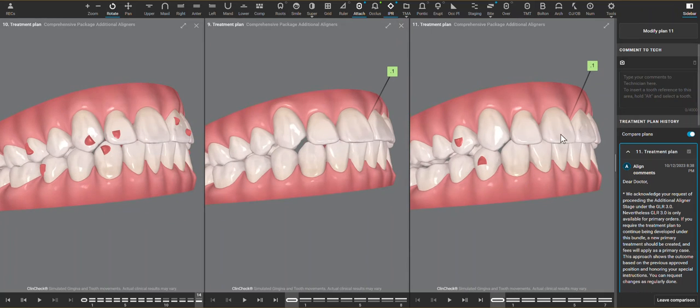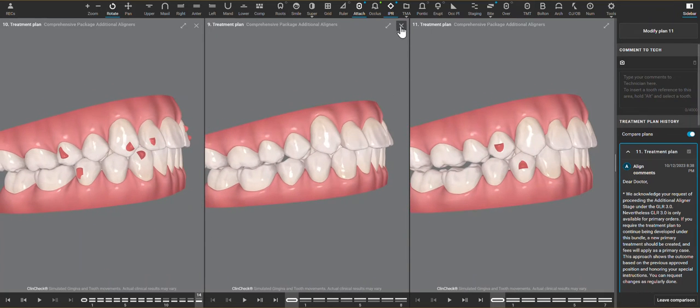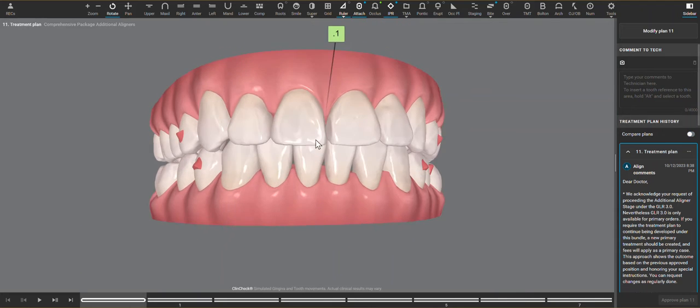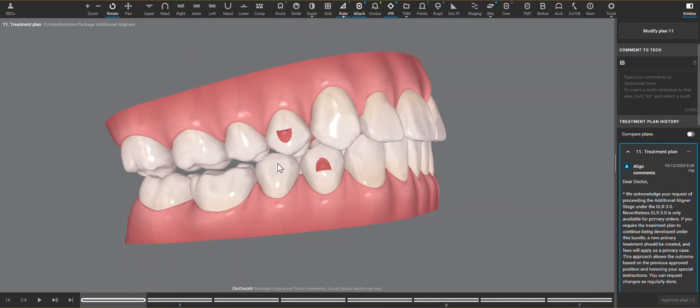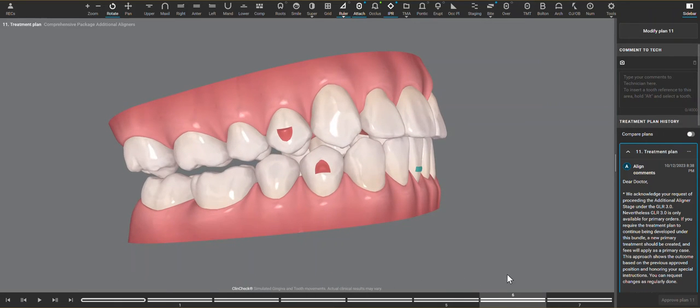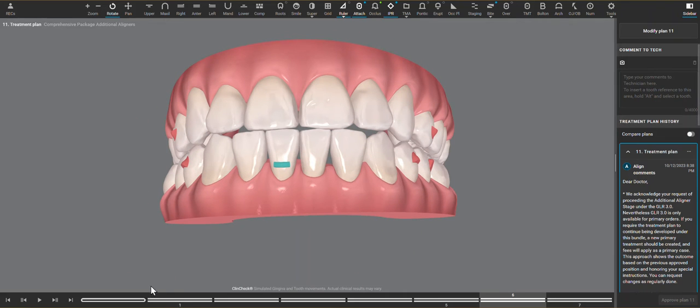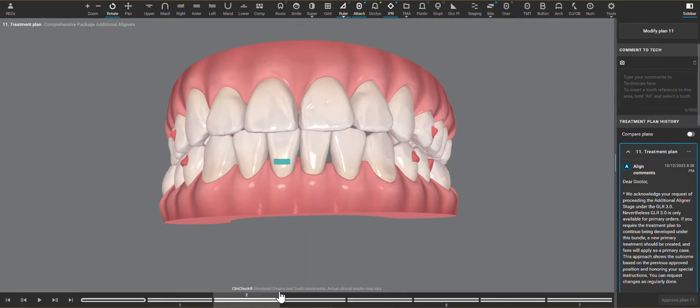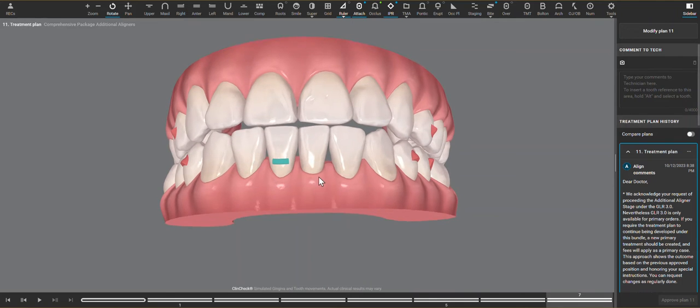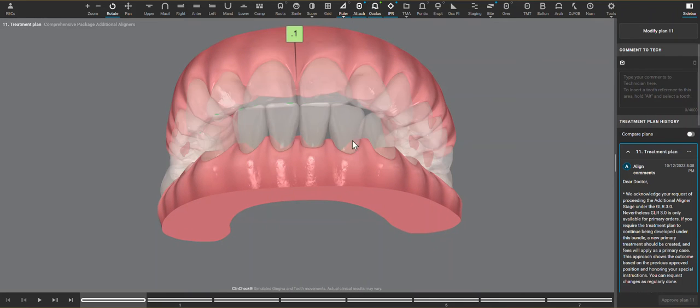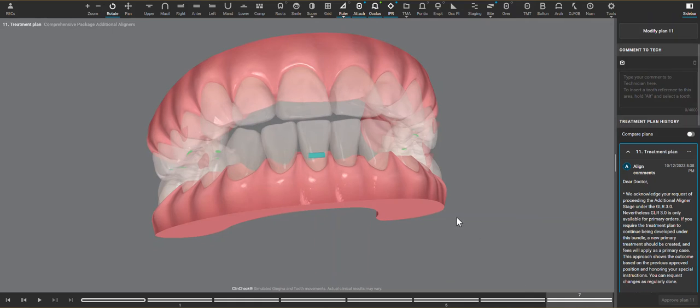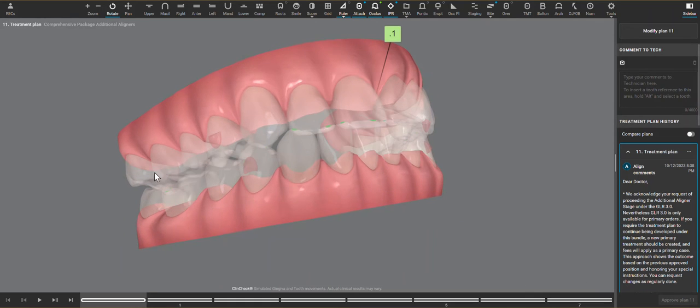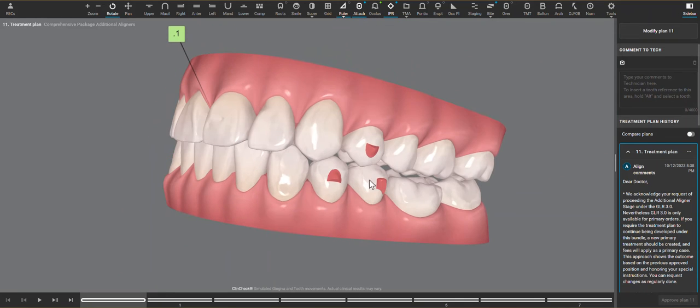Now we are here at treatment plan 11, and knowing that we definitely want to add bite ramps into this at this point. Doing extrusion of the posterior teeth or all of these root torquing movements I think isn't going to be helpful in the posterior, but I do like the anterior intrusion and relieving what is still now interfering contacts in the anterior. That is absolutely what needs to happen. If we can do that while holding the posterior teeth as our anchor teeth, then this is going to be predictable.